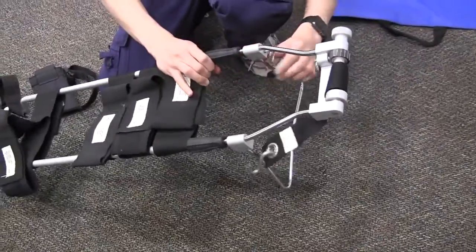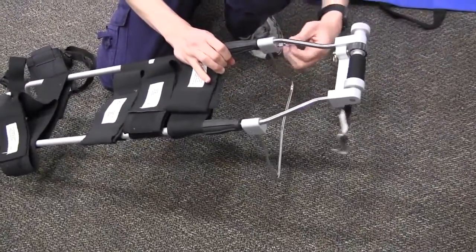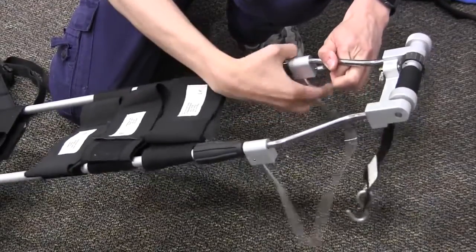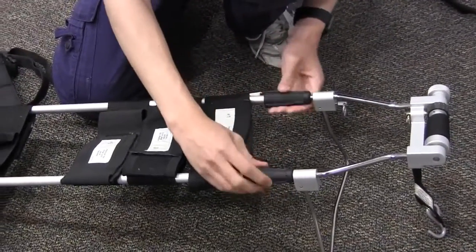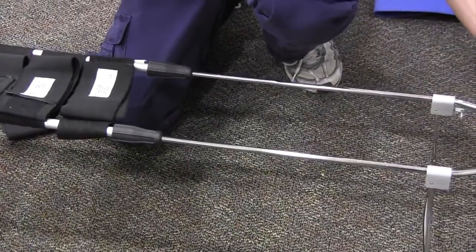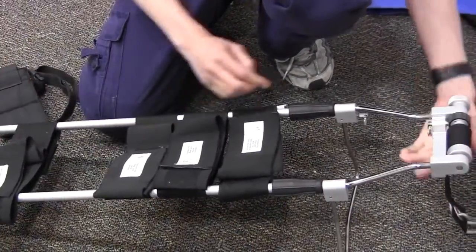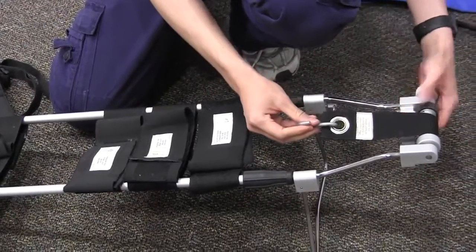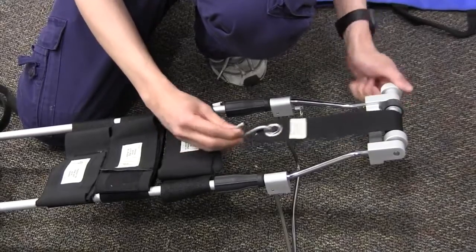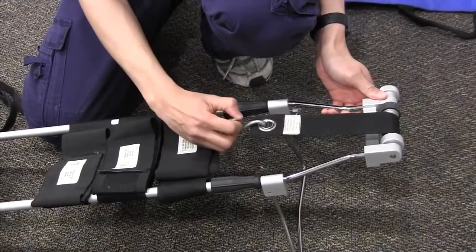Here's a kickstand that you can engage. To disengage it, you pull this ring and pull it back to have that up. You can spin these dials to loosen the splint and adjust its length. Here's the apparatus that will help you apply mechanical traction.